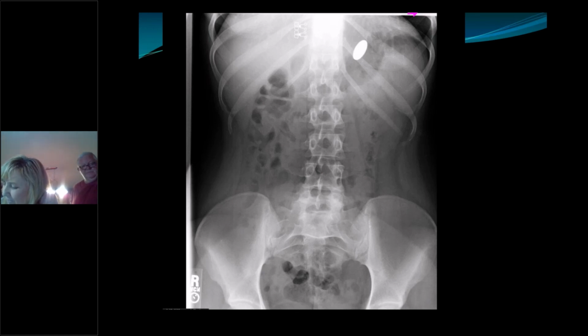If you want to be a little more dignified, you can get an x-ray in a couple of days. Now, this is a little different than a kid swallowing something that's of concern. With kids, and I'm not a pediatric person, so if you guys are out there, correct me if I'm wrong, but in pediatrics, you typically want to include all the way up to the chin, make sure there's nothing stuck up by the carina.